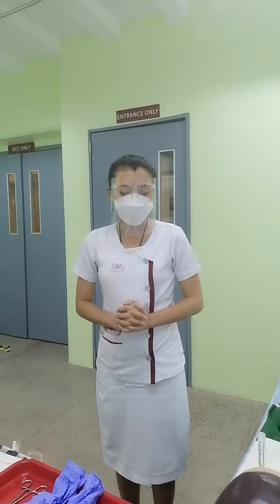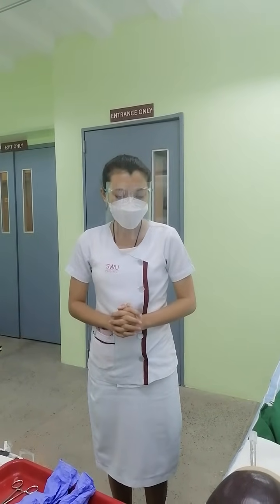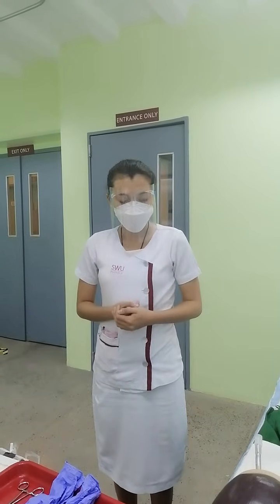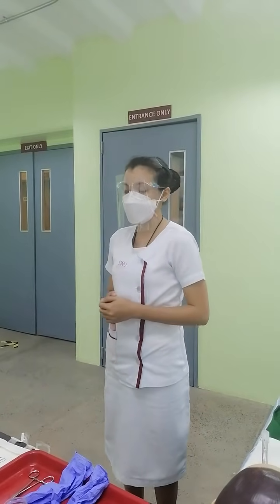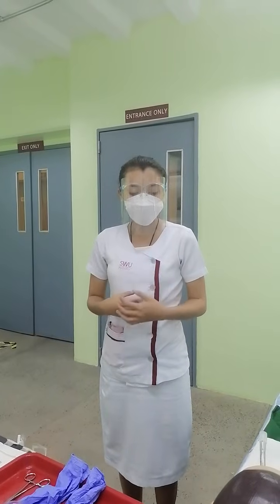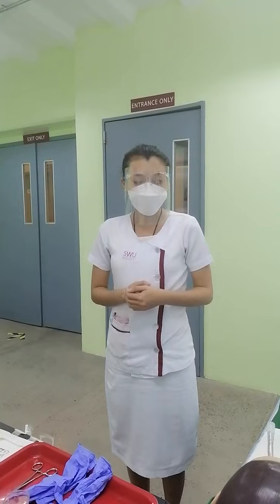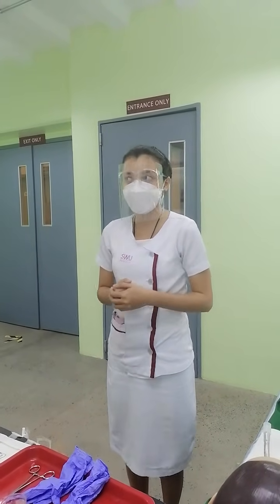First is how to assess the patient's respiratory status, secretions, and oxygen levels. This is done by auscultating the patient's lungs and observing if there is any presence of crackles. If there is any presence of crackles, it means the patient is in need of respiratory suctioning because crackles indicate there is fluid in the lungs. Then, you can use the pulse oximeter to measure the oxygen saturation and respiratory rate of the patient.